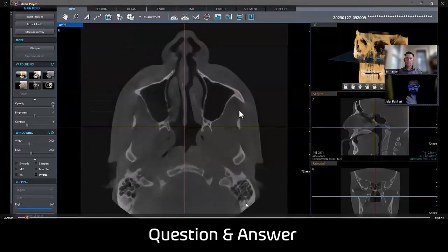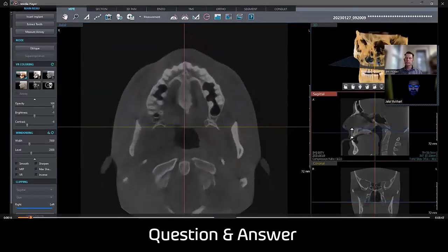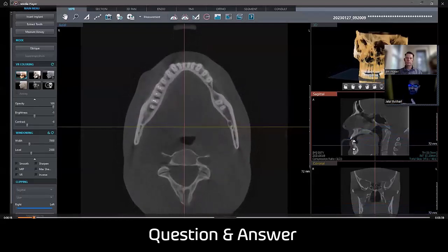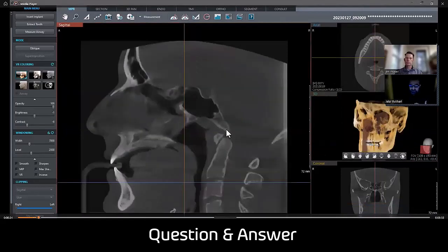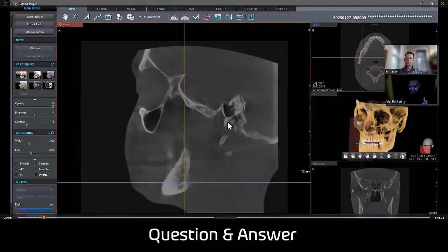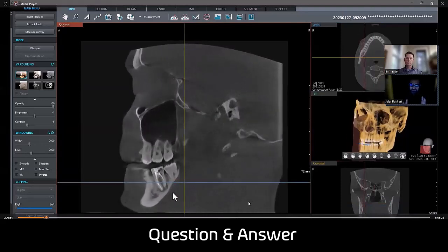Absolutely. The best thing is that CBCT software these days gives you so many options on different capabilities. We can change certain aspects of the image, make the image more enhanced, and see different areas in different formats. It really gives you a great idea of what we're looking at in different terms.